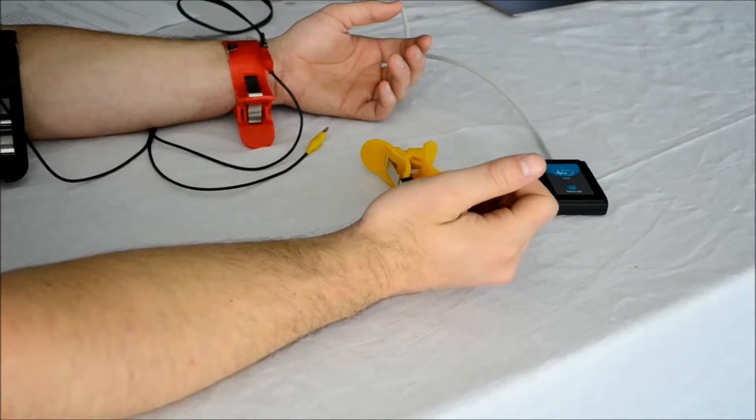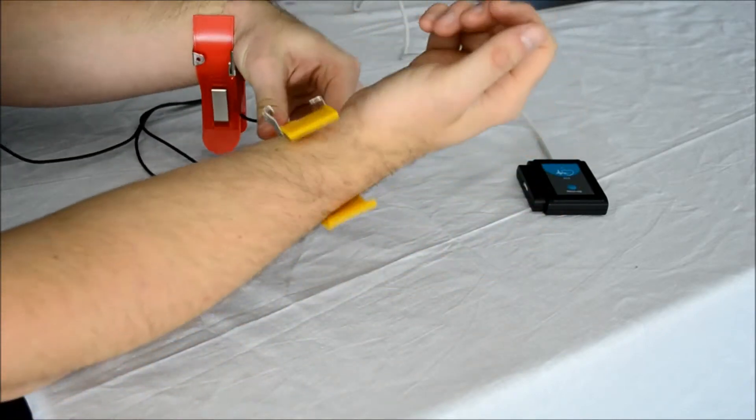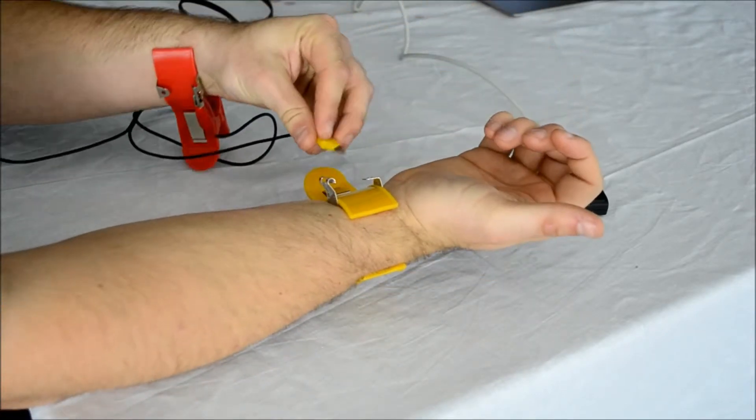To connect to the electrocardiogram sensor, simply connect the clips to your arms or legs and attach the alligator clips to the metal loops.